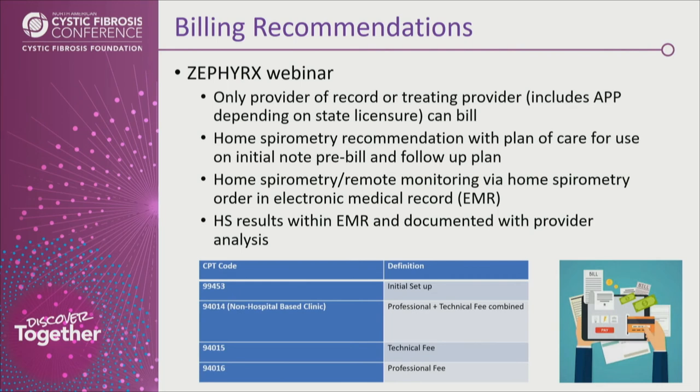But we don't do that, because all of our home spirometry is done and controlled by the care center. None of our home spirometers are facilitated or reviewed or touched by our PFT lab. Everything is done within the care center. So it's up to your institution to decide, because we realize that the PFT lab already had a lot on their plate and loss of staff, so we decided to take this on. We also knew right up front that we needed to put the results within the EMR, which is why the dashboard was the best choice for us, because it is that PDF form that we could upload directly into the chart under a remote monitoring folder.